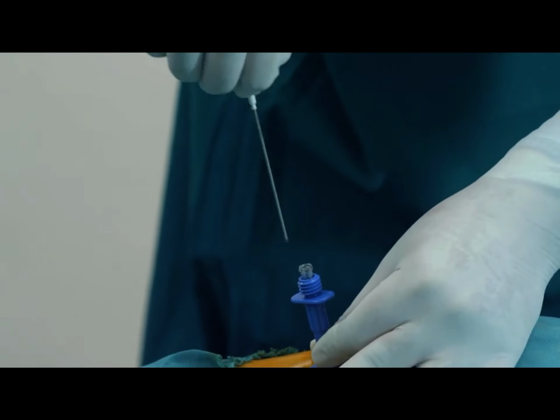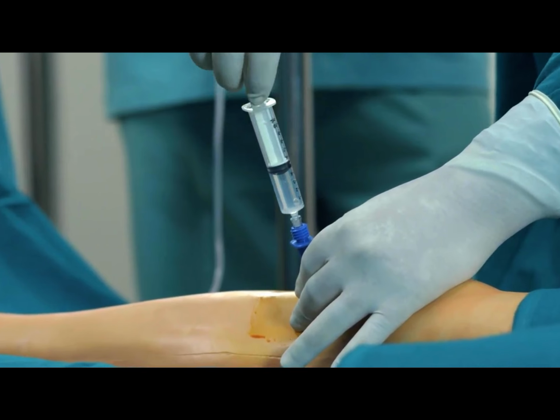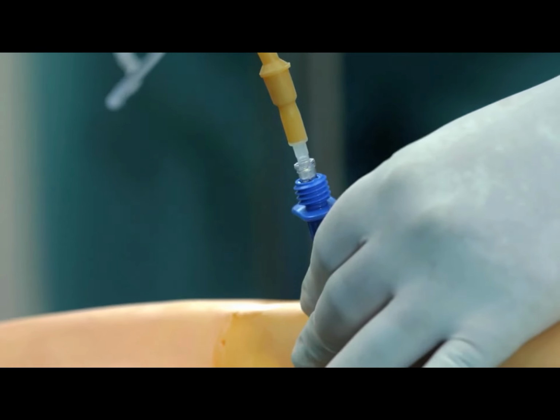Now remove the stylet and connect a 10 cc syringe to the needle. Aspirate for blood or marrow contents or both to confirm correct placement. Make sure that the fluid flows easily with no resistance.